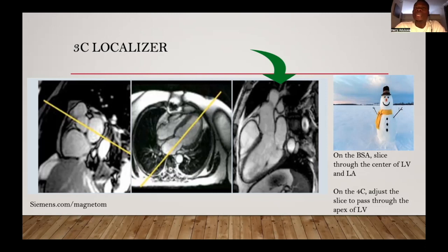So what I do basically, it's not a general rule, it's just scan dependent to me. I delay my white blood till getting to the end of my scanning before the injection of contrast, and then I run it. At that point, I've gotten the basic images that my radiologist needs to give them the best. But I have also come to learn that not all cardiologists or radiologists want the white blood. With the dark blood and the basic BSSFP images, they are okay. They can run their scan and so on and so forth. So the white blood is center dependent.